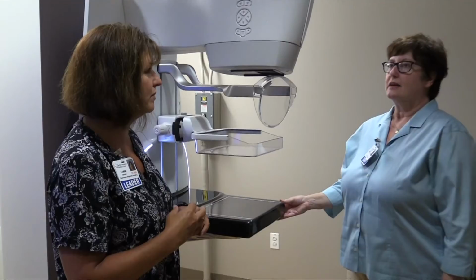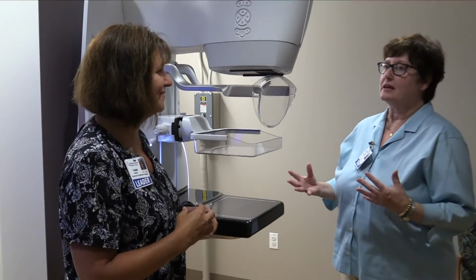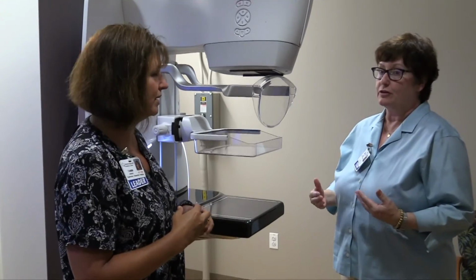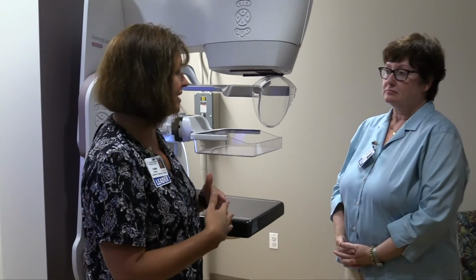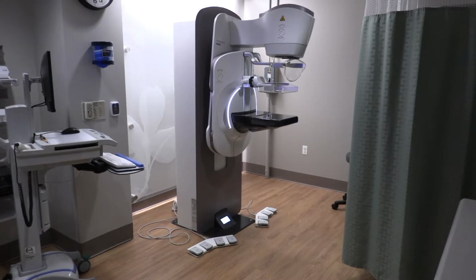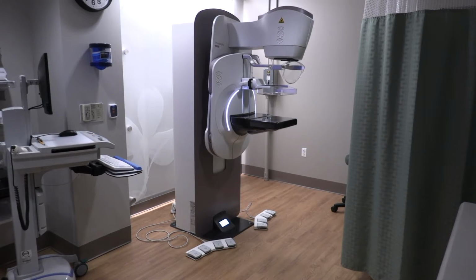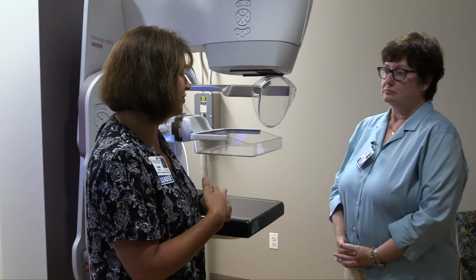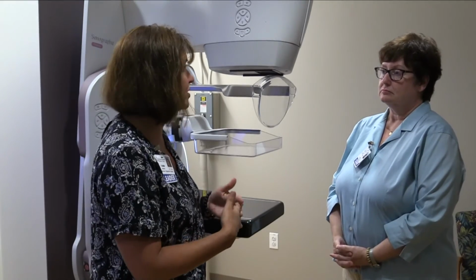So Tammi, why don't you kind of do, not an actual simulation of a mammogram, but maybe explain the process, maybe for someone who's never had a mammogram, and they're coming into the room, what takes place? Okay, our patients enter the exam room and they'll come and change right in the exam room behind a curtain, so very private. And in this same exam room, the technologist will review the patient's history and their information and get some information on why they're having this or what they're concerned about.